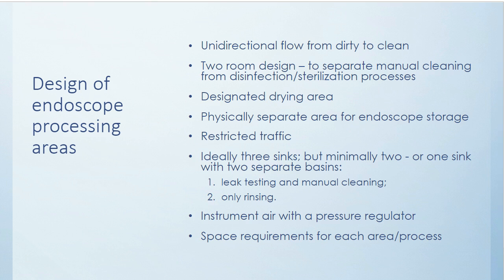We need sufficient space and sufficient design of the endoscope processing area, because there are studies that show that the aerosols we create when brushing and flushing these scopes go 4 feet at least, and in some recent studies up to 6 feet or more. So we need that separation and a large enough room.